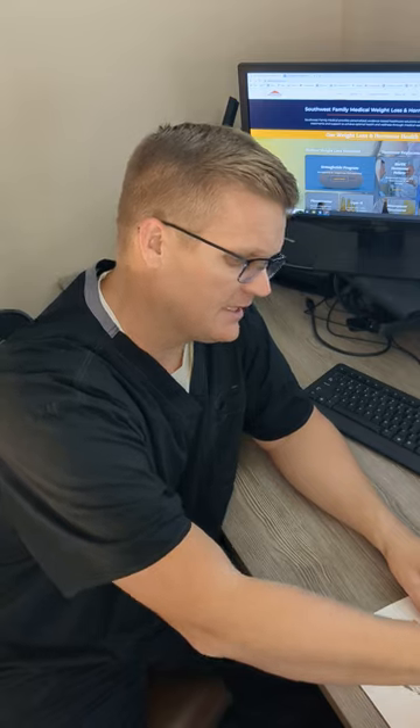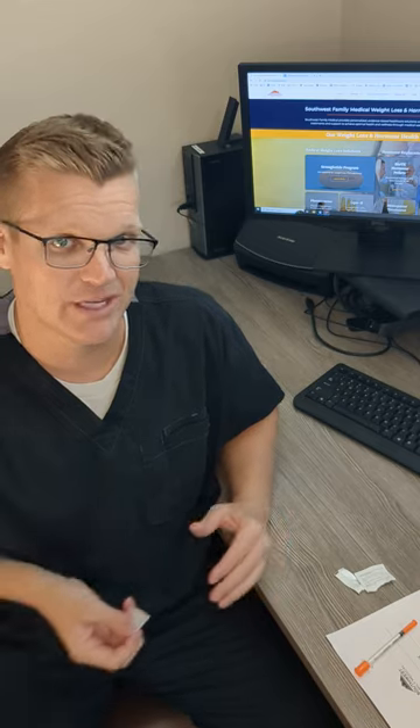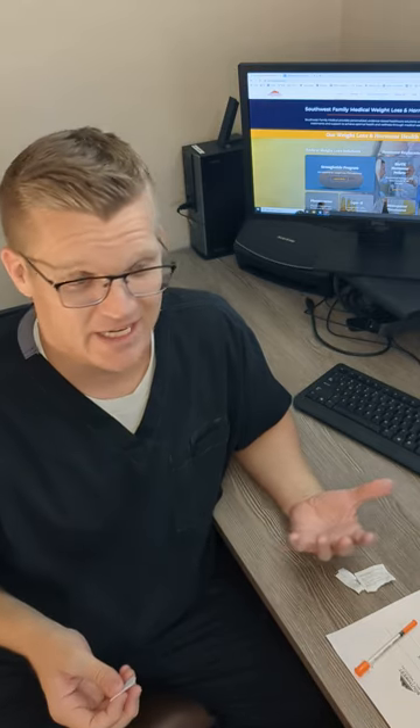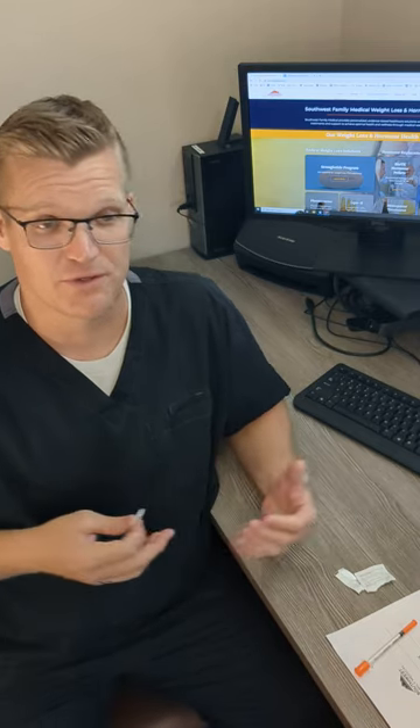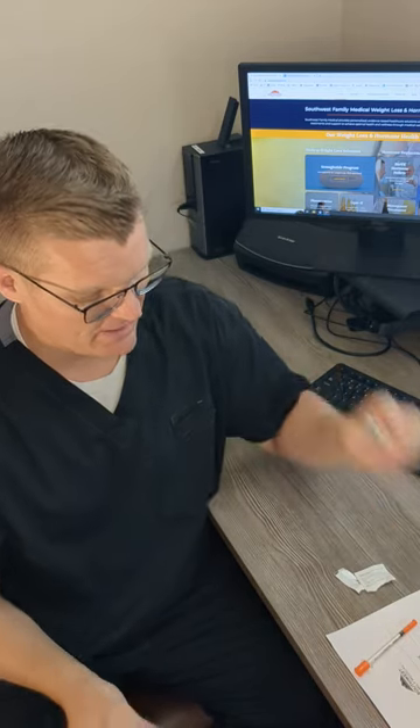So the first thing you do is grab an alcohol wipe. You can buy a box of these at Walgreens for literally about $4.95 for over 300 of them, so it'll last you a whole year. You just wipe off the top of the bottle like that.